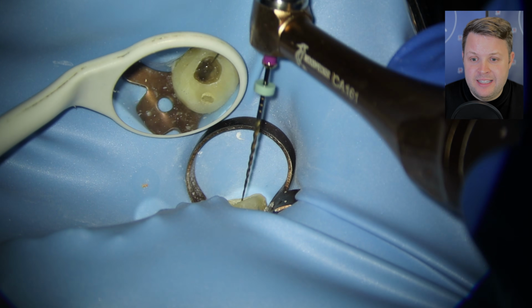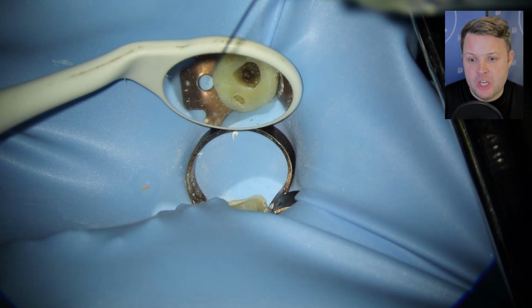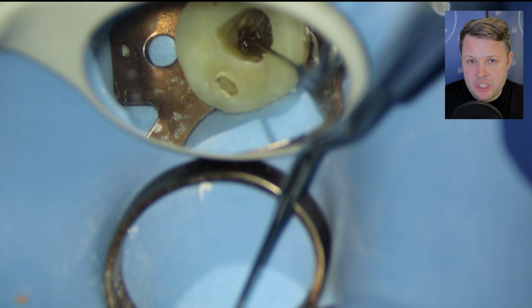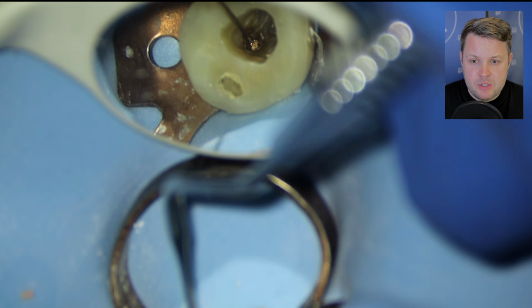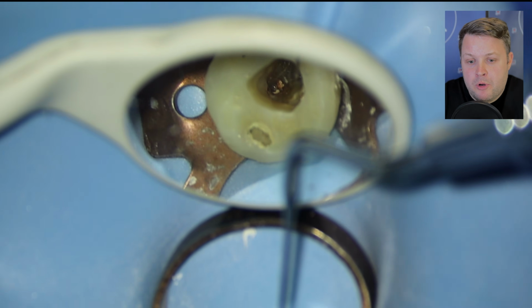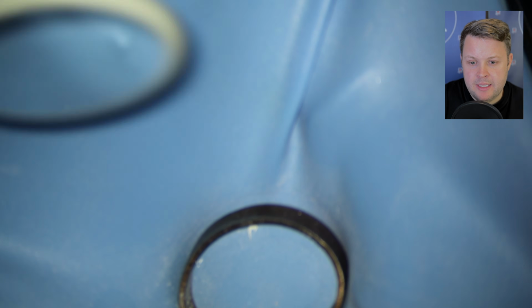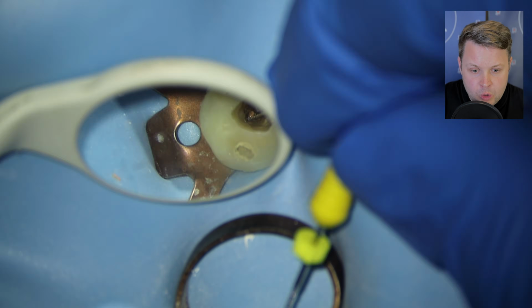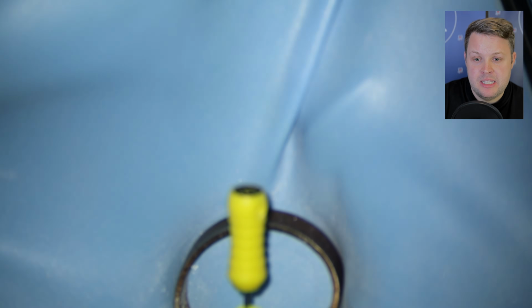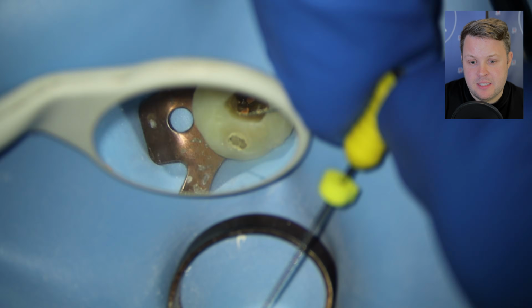In desperation, I'm using this size 10 glide path file just to see if I can negotiate. Sometimes it does slip past, but it's just not negotiating to 0 at all. I'm going to use this really long probe. I don't know what this probe is called, but it's like a DG endodontic probe. I'm slowly trying to pick the GP away from the wall using a succession of hand files, Hedstrom files, some C+ files, and I just cannot seem to get past a certain point.